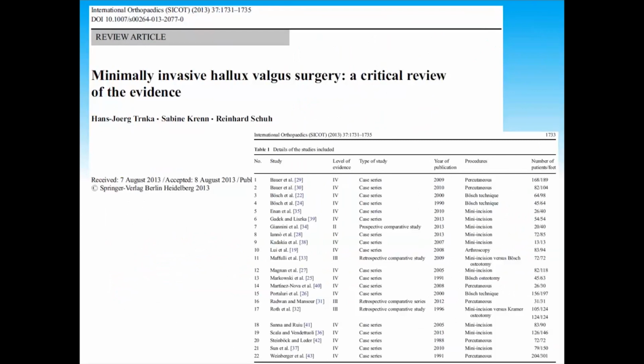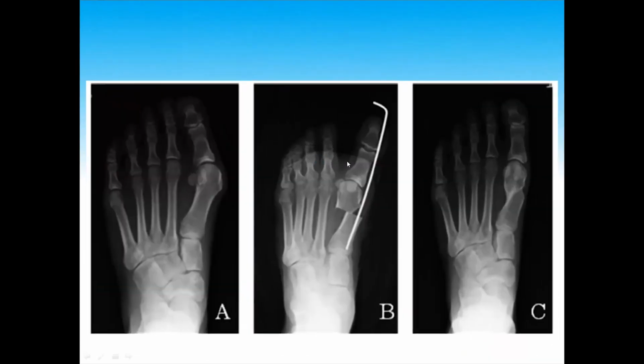Minimally invasive hallux valgus surgery. There have been many authors. It's been around for quite a while, as far as the MIS technique for this bunion correction. This is the typical approach, where the MIS procedure was done by cutting the bone and shifting the bone, either with a burr or a saw. And then it was just pinned, relatively stable, not ultimately stable. The capsule was kind of shish kebabbed with the pin, and the pin was external.